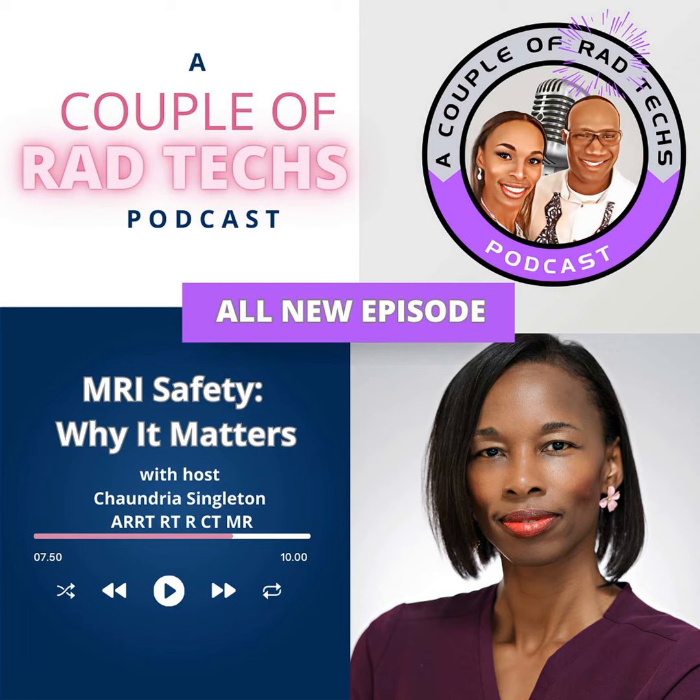What else do you think could be attractive? What are some of the everyday things that you may have in your pocket that, if you don't change for your next MRI scan, could actually become projectile objects? I'm just going to say a hairpin, because I wear hairpins all the time. I've seen them fly out of people's hair.